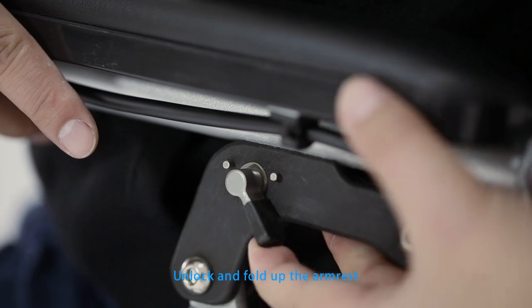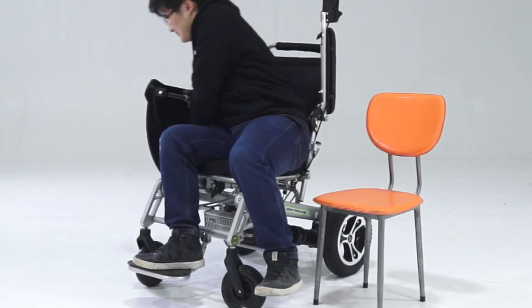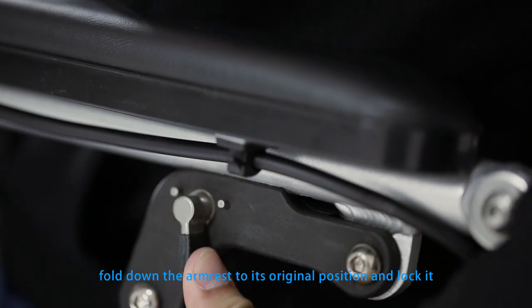Unlock and fold up the armrest. Be careful not to use excessive force and fold it over the allowed angle. After seated properly, fold down the armrest to its original position and lock it.